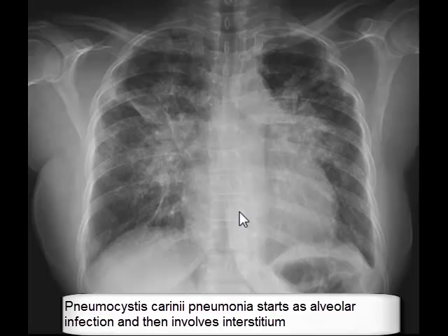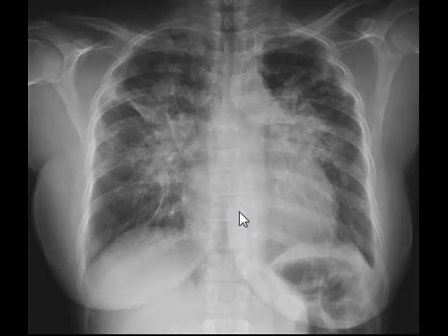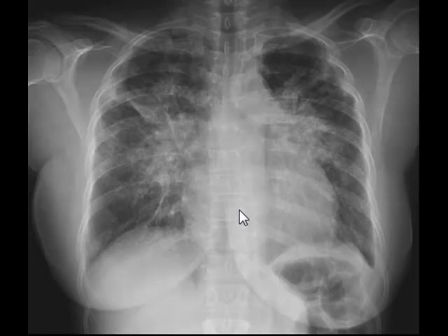The radiological appearance of both pulmonary edema and Pneumocystis carinii pneumonia can be exactly the same, as in this case. The difference, however, is that Pneumocystis carinii pneumonia is an infection causing accumulation of exudates in alveoli and then involving the interstitium, versus pulmonary edema, which is a leakage of capillary fluid into the interstitium and then into alveoli, either because of congestion or increased permeability of capillaries around the alveoli.